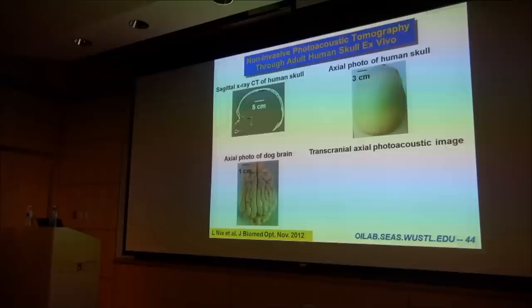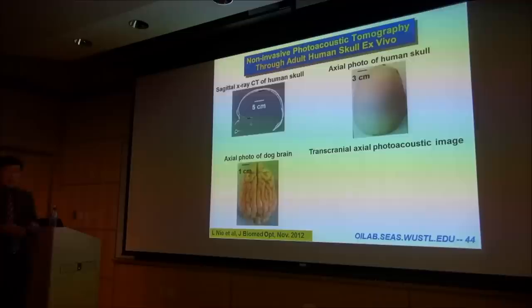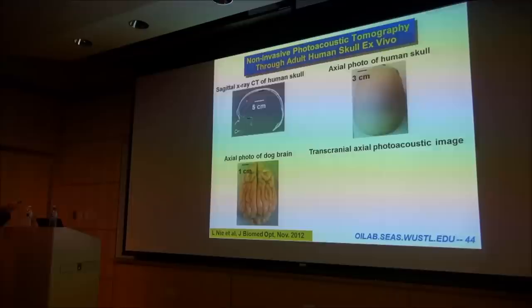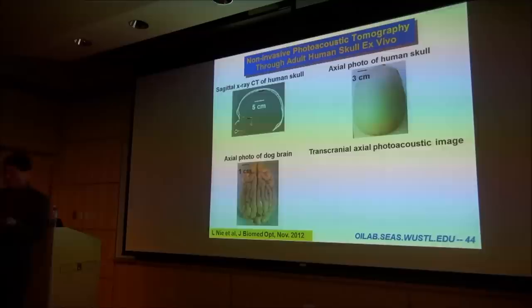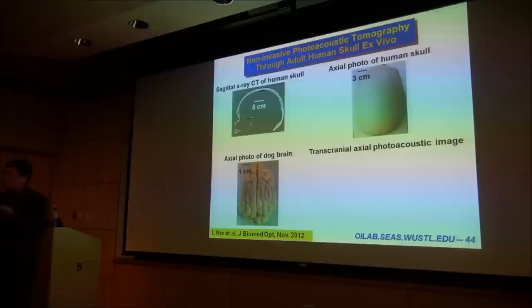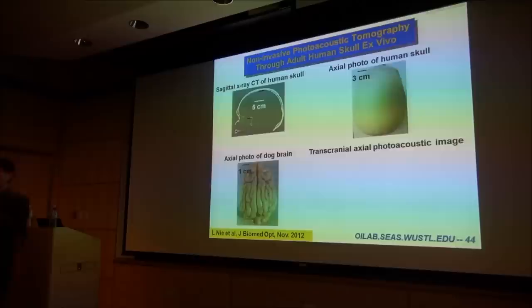So we're trying photoacoustic tomography in the human brain, crazy enough to try if it'll work in the adult human brain. The major challenge is this thick skull. Right? This is how our brain is protected. Pulse-echo ultrasound in adult brain doesn't really work very well. So that's a major challenge. How do we convince people that in photoacoustics you have a better chance? We do have some advantages in our favor because the photoacoustic wave goes one way out. And the pulse echo only returns maybe 0.1% of your signal back in amplitude. So it's a small percentage of the ultrasound signal that will return for pulse-echo ultrasound imaging.